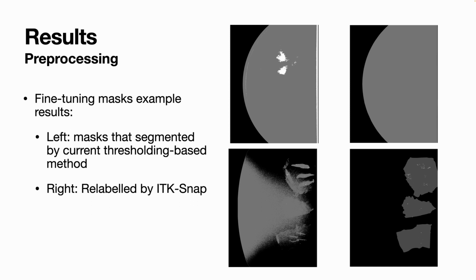As you can see on the right side, these 2 masks are reliable, made using ITK-SNAP based on the original images.